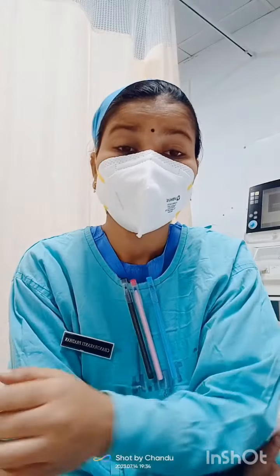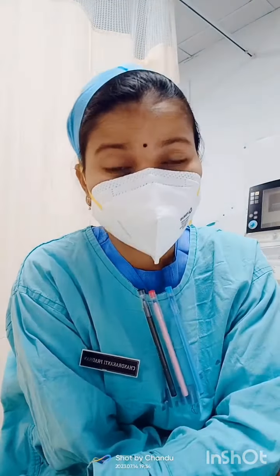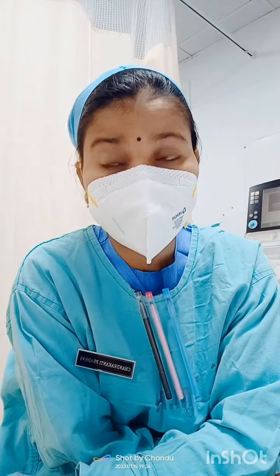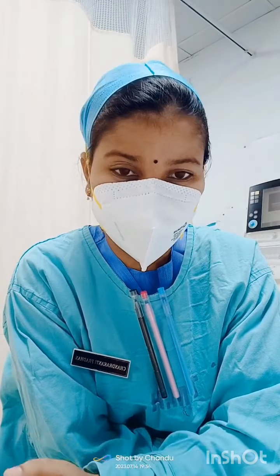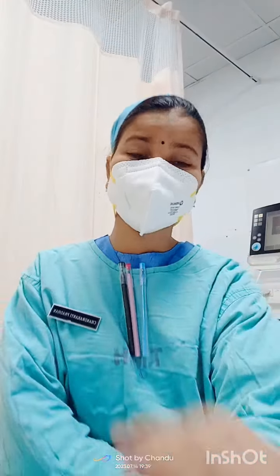The difference between monophasic and biphasic defibrillator is that the monophasic defibrillator provides a higher amount of energy compared to the biphasic defibrillator, and in a monophasic defibrillator one paddle provides the energy. In a biphasic defibrillator both paddles provide the energy to the patient.